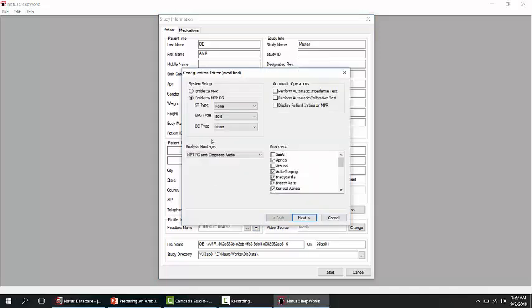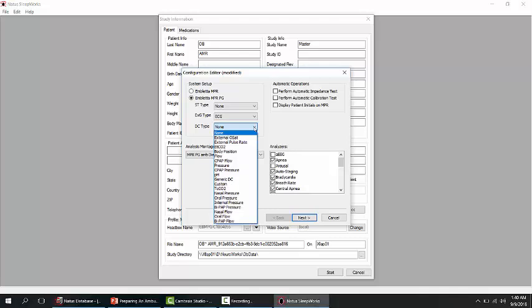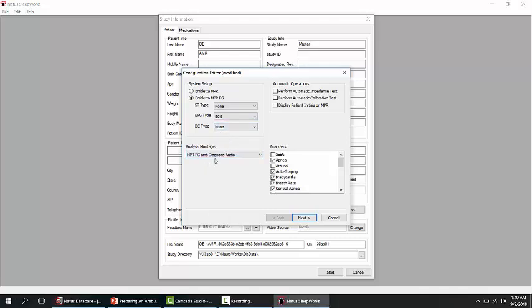From the system setup information, you can choose if you want to record the ST or the ST Plus Proxy. You can also redefine the EXG channel to record ECG, EMG, or EOG. If you also want to record a DC channel, you can select one of the predefined channels. You can also choose one of the default analysis montages.